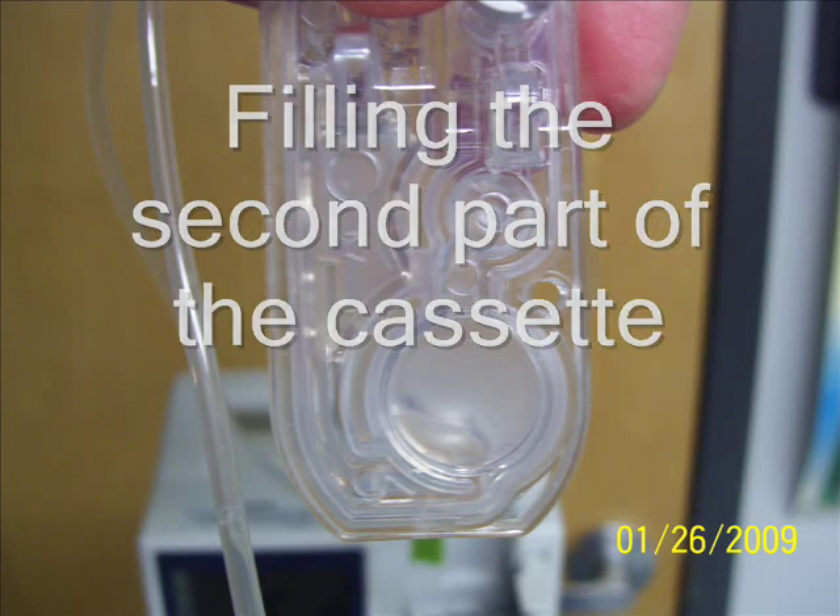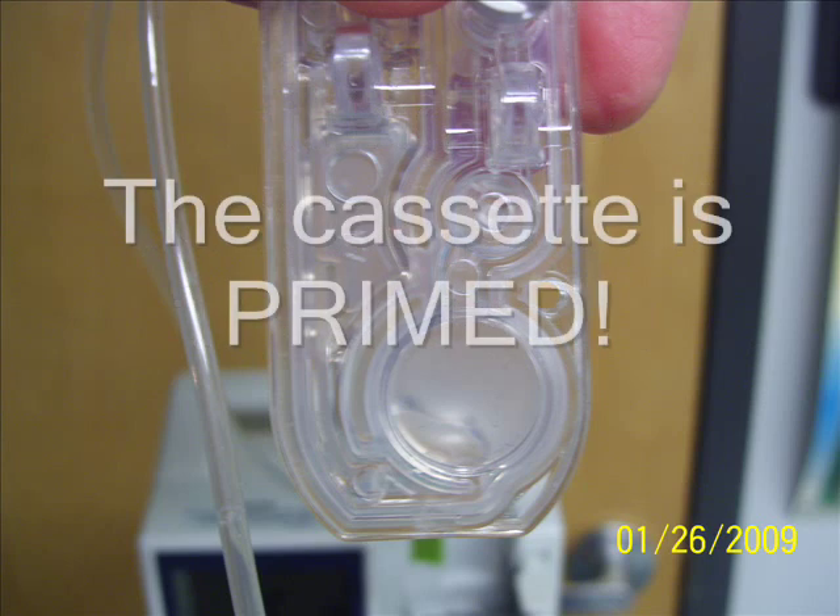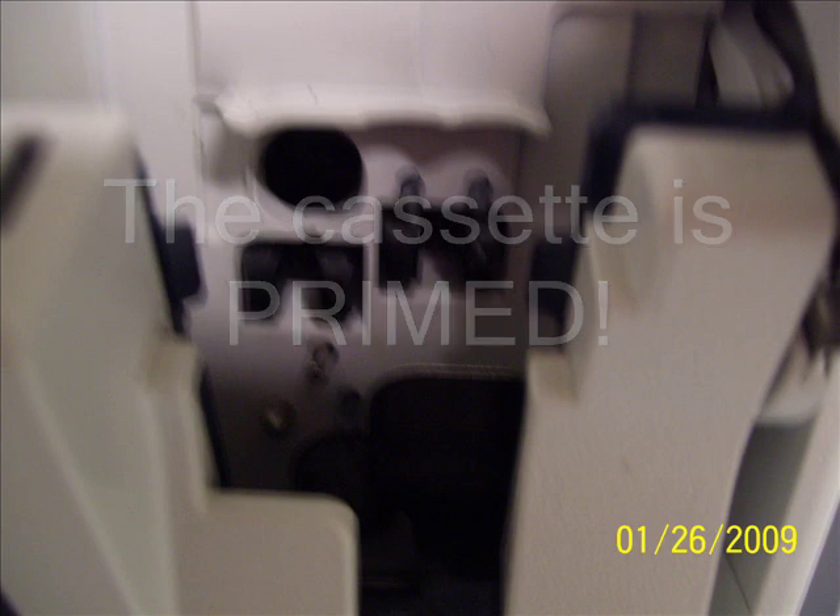With the first drips inside of the circle, we flip the cassette upside down again. This is filling the second part of the cassette. This circle that you see is filled, and when the fluid goes through that, the cassette is primed and we are continuously priming the rest of the tubings.